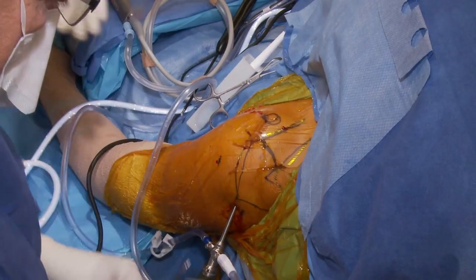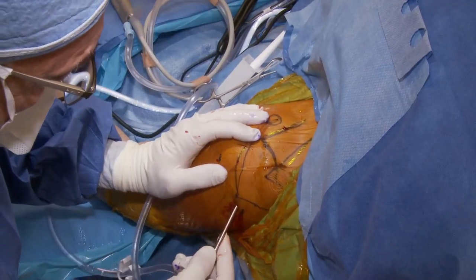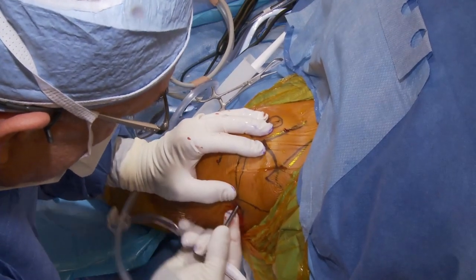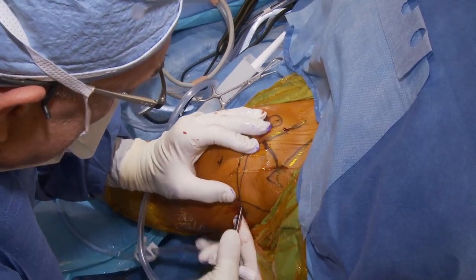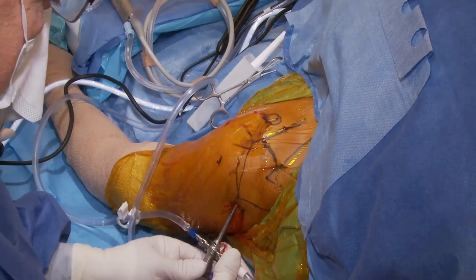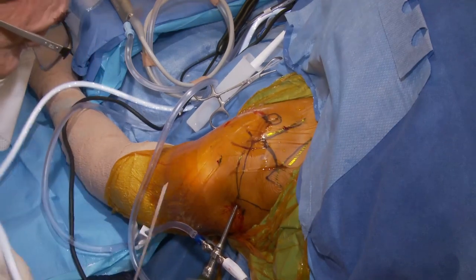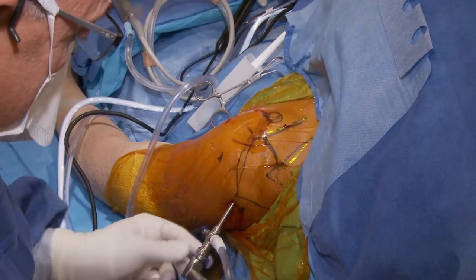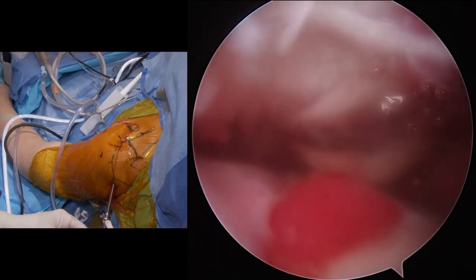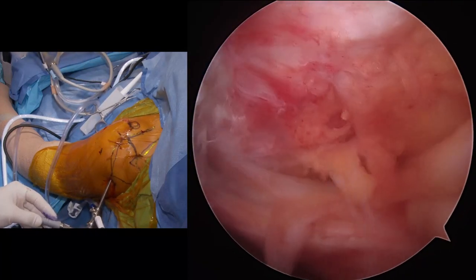When we're going into the subacromial space, we'll go through the deltoid, and once we feel the rotator cuff, we'll tilt our trocar up and feel for the anterior lateral corner of the acromion. Once we can brush against that, we know we'll be in the area that we call a room with a view. This will give us a wide open view above the rotator cuff so that we can see very nicely where we need to do our surgical procedure. So we're over the top of the rotator cuff, and you can see, as we have throughout the entire procedure, it's very inflamed here.